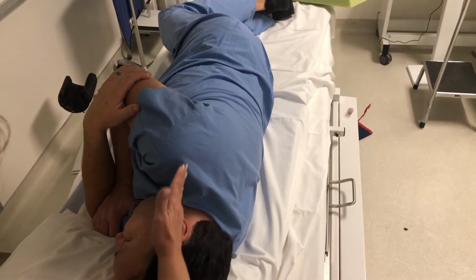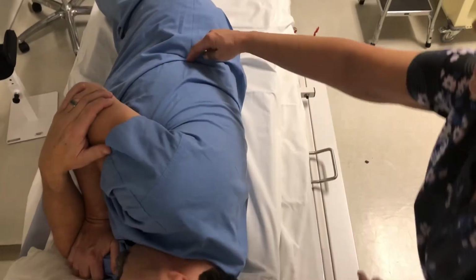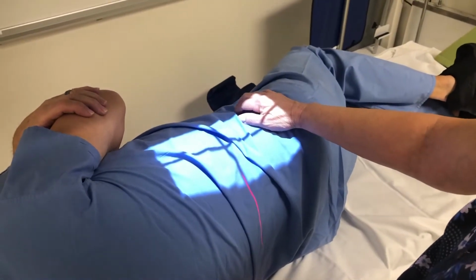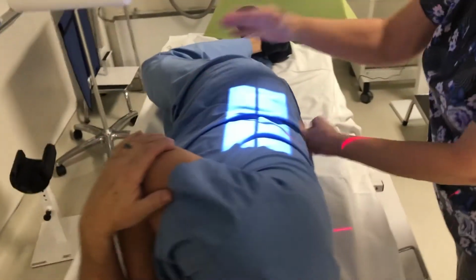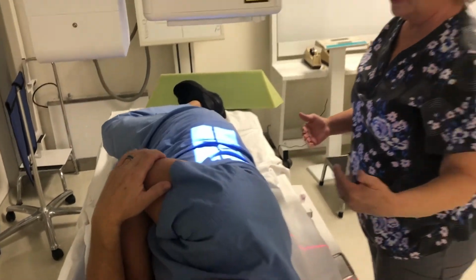So if I'm looking at the C-spine, I should be on the same coronal plane as his C-spine. And if I double checked and I palpated ASIS, I'm about 3 inches back. So they both work. You may hear other tips and tricks from your technologists.